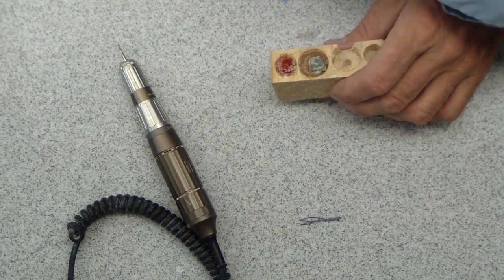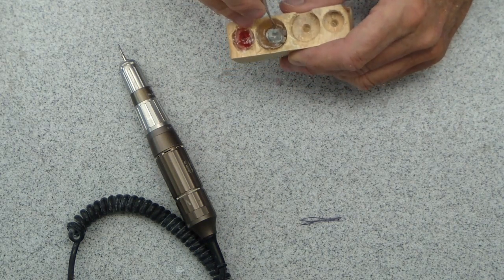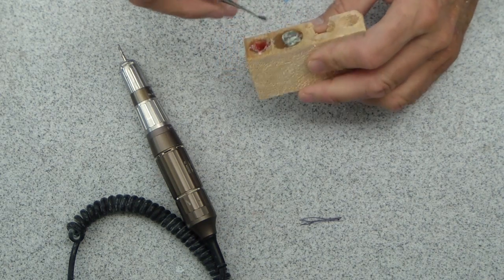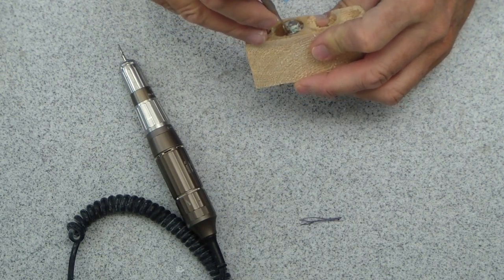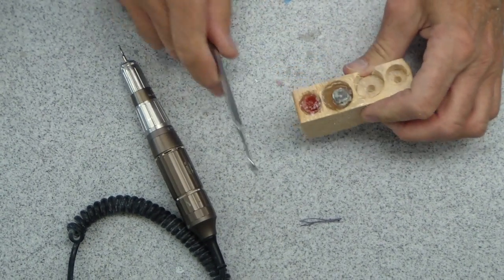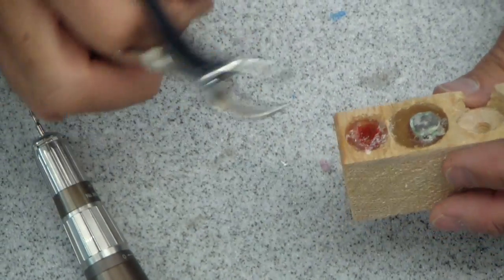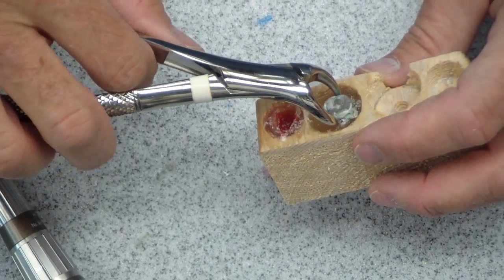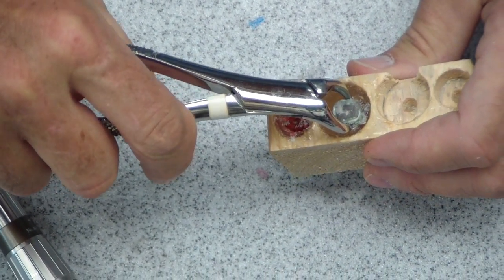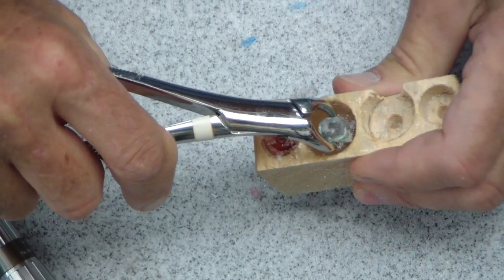You can get the Woodson elevator down in there a lot deeper. And so that allows you to get a lot better leverage with your 23 forceps. This will sink right down almost into the furca there and you've got a good grip, and I could probably take that tooth out right now without too much trouble.